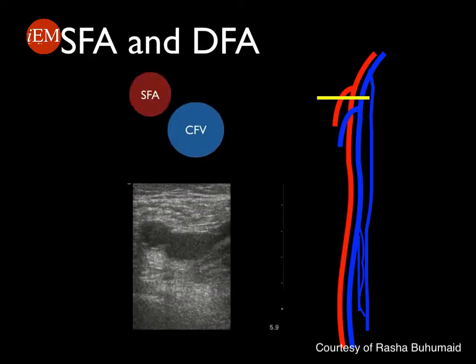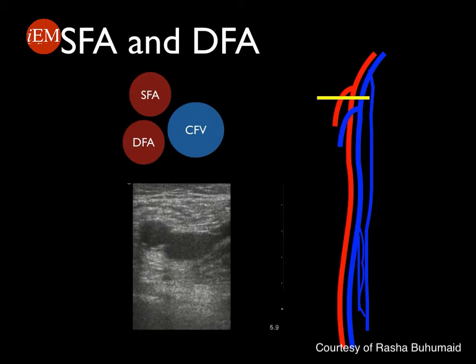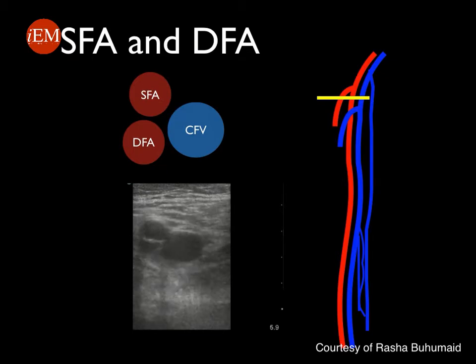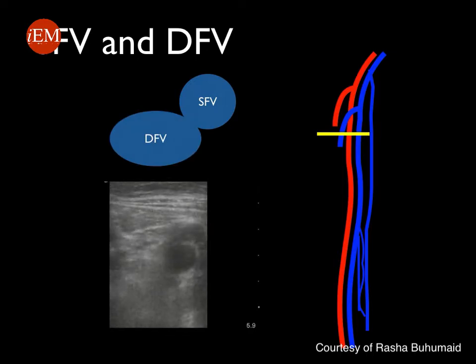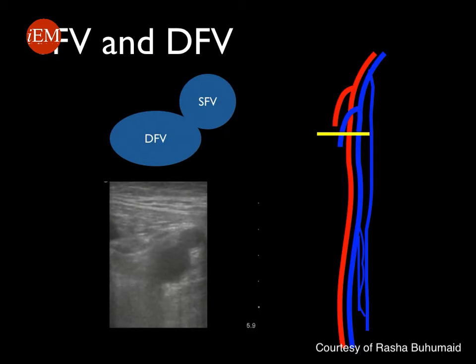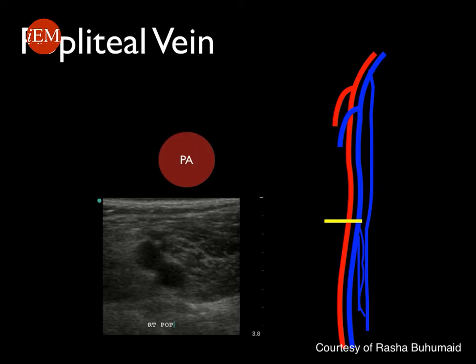Moving more distally, the common femoral vein lies medial while the common femoral artery has already divided into the superficial and deep femoral arteries. Moving even further distally, the common femoral vein itself becomes the superficial and deep femoral veins. At the level of the knee in the popliteal fossa, the popliteal vein runs on top of the popliteal artery.